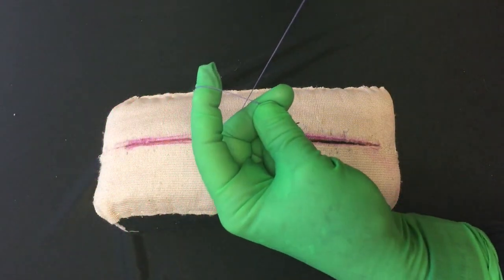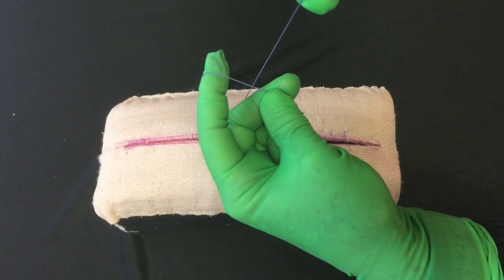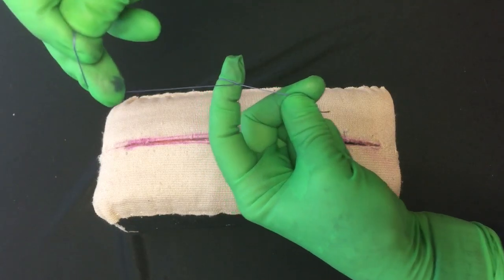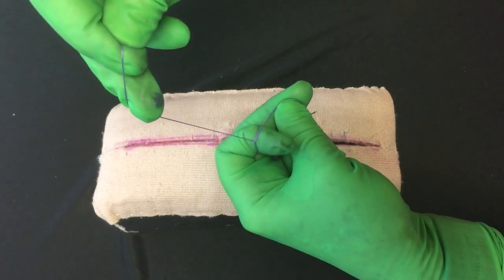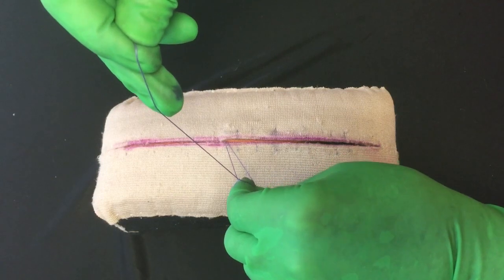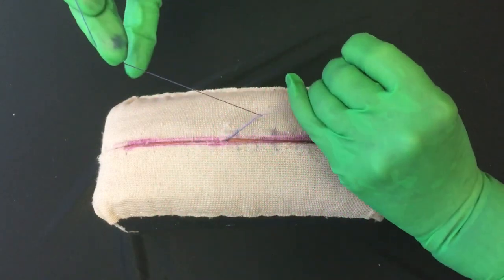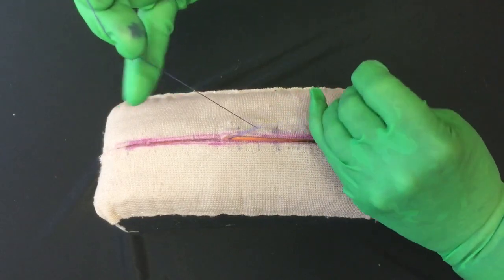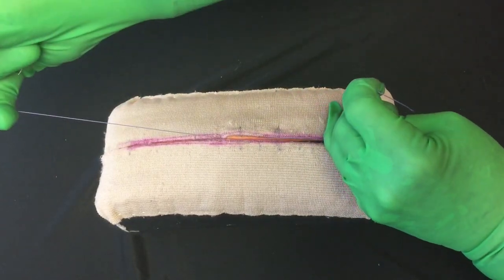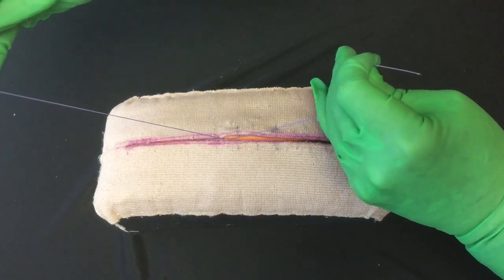Now that I've left it at my index, what this has done is set me up for my next throw. So now I go across and you see that X again. Again I'm going to dive where my thumb is holding it. Catch it between there, and this time I'm going to put my three fingers on top of the suture and I'm keeping that tension that's going to tie it tightly. Once you get the second one, it's tight.